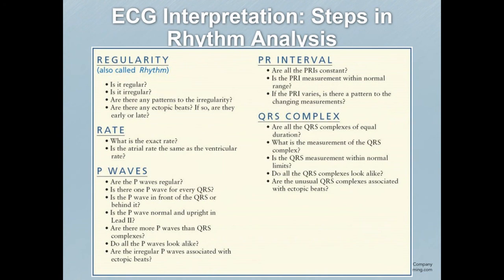Suppose I had a patient who was in AFib, who was very irregular. When you place patients on a monitor and find they're in AFib, you'll see the rate constantly changing. So by taking that irregularity, I could take a small number and a big number and calculate a range. But that's for down the road a little bit. I want to know, is it regular? I want to calculate my rate.